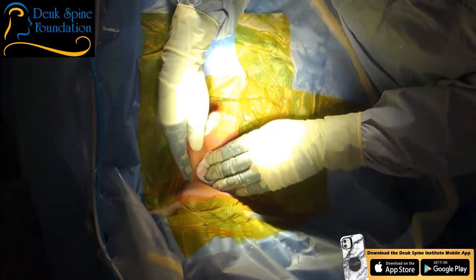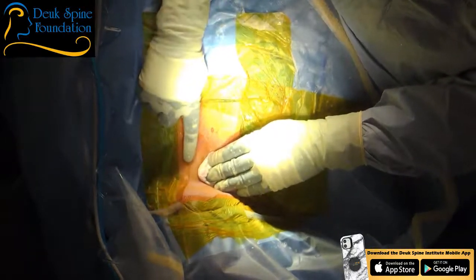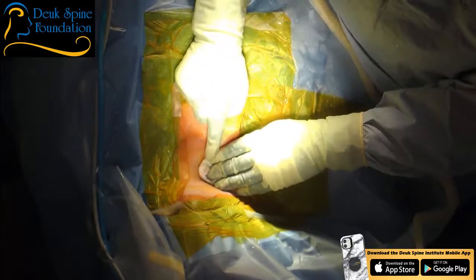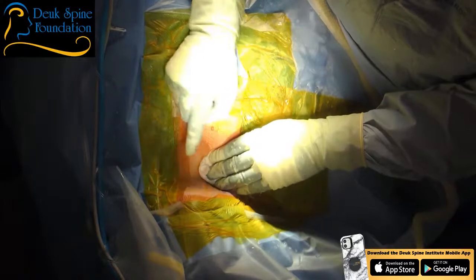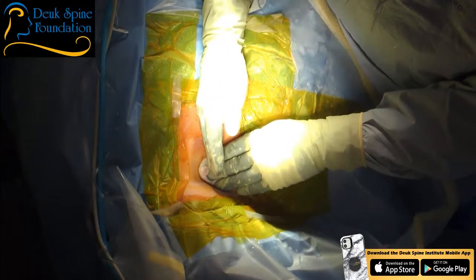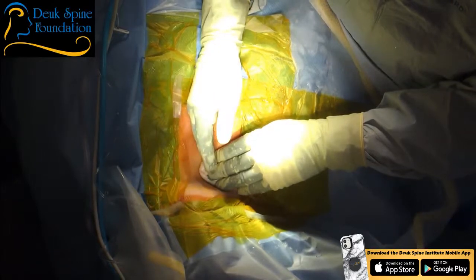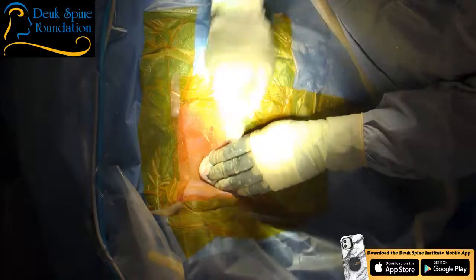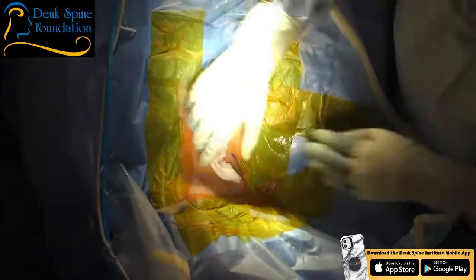The middle of her neck is right here. So I'm off to her right side, and I take a path between the trachea and esophagus, in the middle, the carotid artery, jugular vein, basically the carotid sheath and the sternocleidomastoid muscle to the outside. I go between them. And that's how I get to the spine.